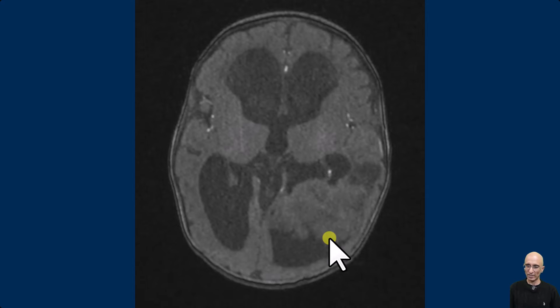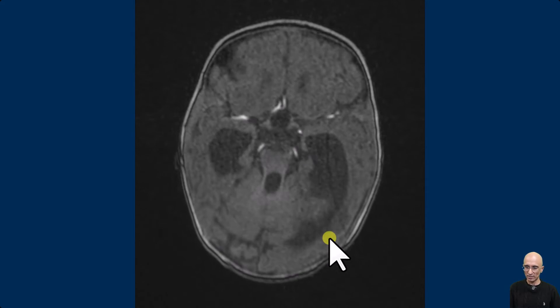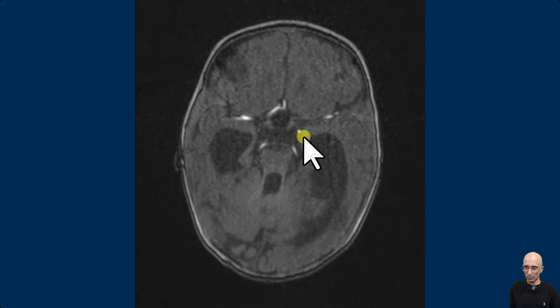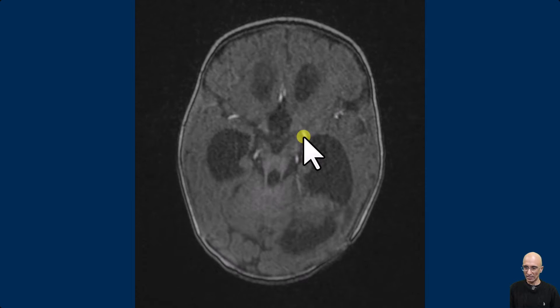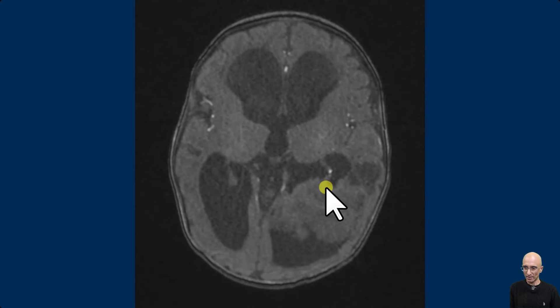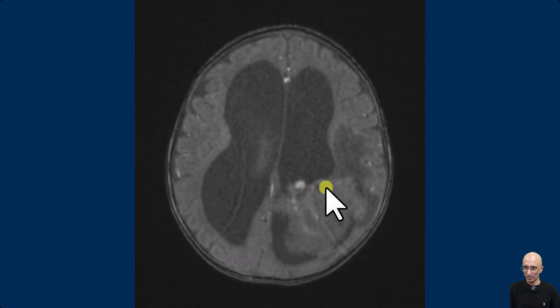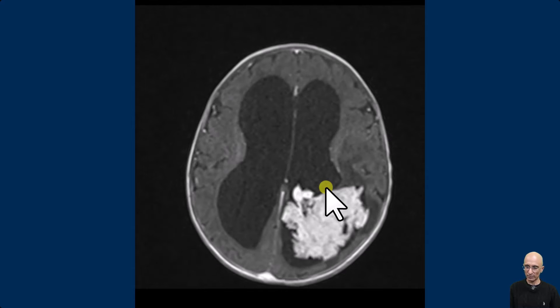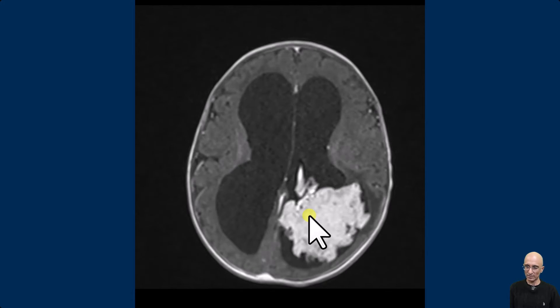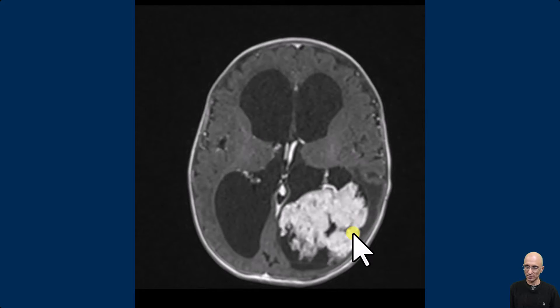The patient subsequently underwent MRI examination. MR angiogram demonstrated a hypertrophied anterior choroidal artery supplying the left lateral ventricular mass. Following administration of intravenous contrast, there is avid enhancement of the left lateral ventricular mass, which demonstrated frond-like projections.